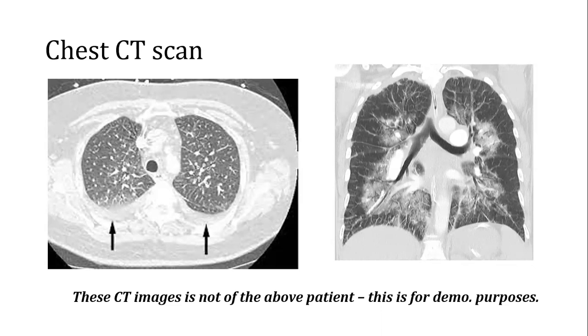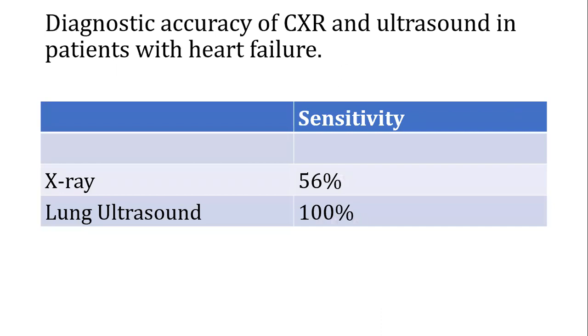So after here, we thought, why don't we go for lung ultrasound? Part of the gist of the matter is again in this slide. This is actually the take home. We started with a chest X-ray, and there's nothing much we could read out of it apart from the so-called interstitial syndrome.